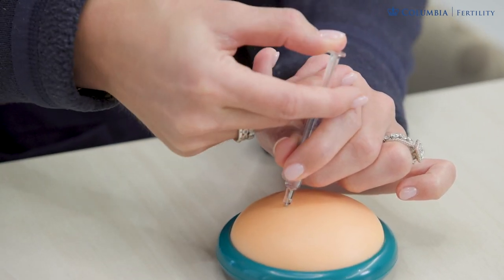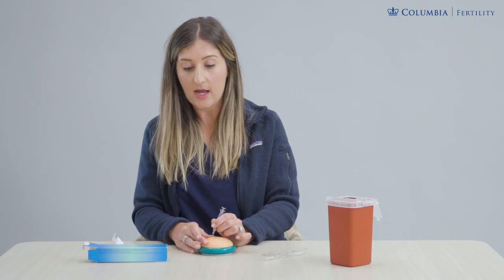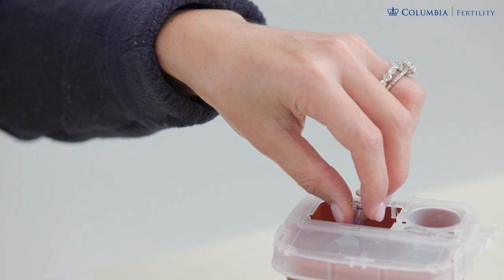Push the plunger all the way down to administer the full amount, then take it out. If you have a piece of gauze, hold it over the site with some pressure. The syringe is now empty and goes directly into your red sharps container.